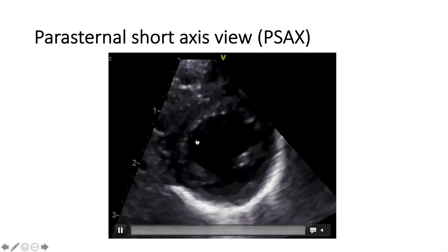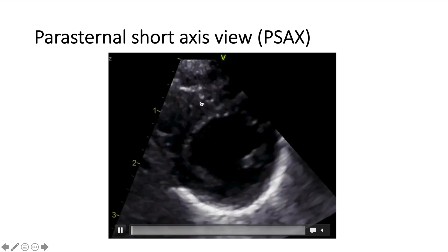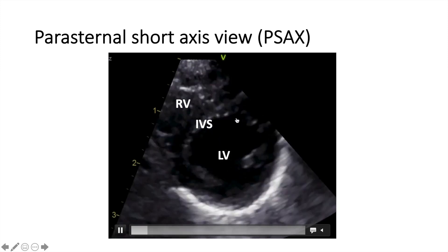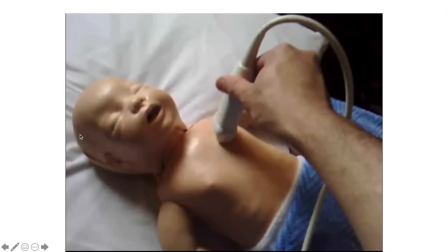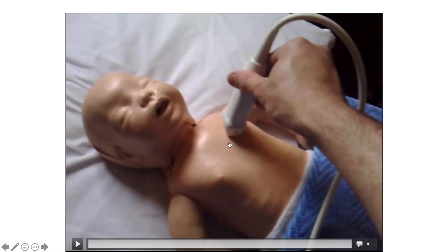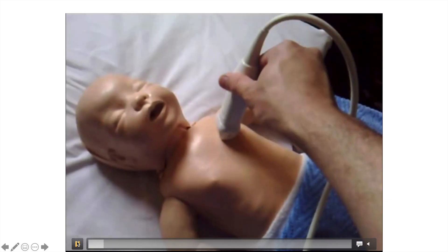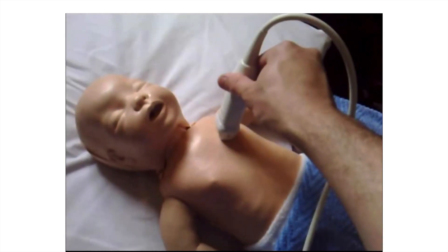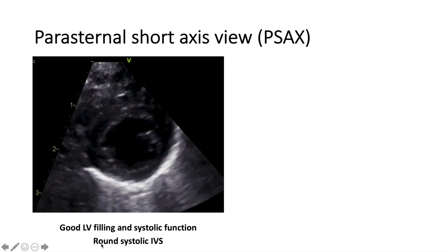Moving to the next view, which is called the parasternal short axis view — as opposed to the long axis view, this is the left ventricular cross-section. On top, you can see the RV, and in the middle is the interventricular septum. To get it from the long axis view, where the pointer was towards the right shoulder, we simply rotate the probe 90 degrees making the pointer towards the left shoulder. Then we tilt the probe up and down to cut the heart at different levels. This is how we get the short axis view.